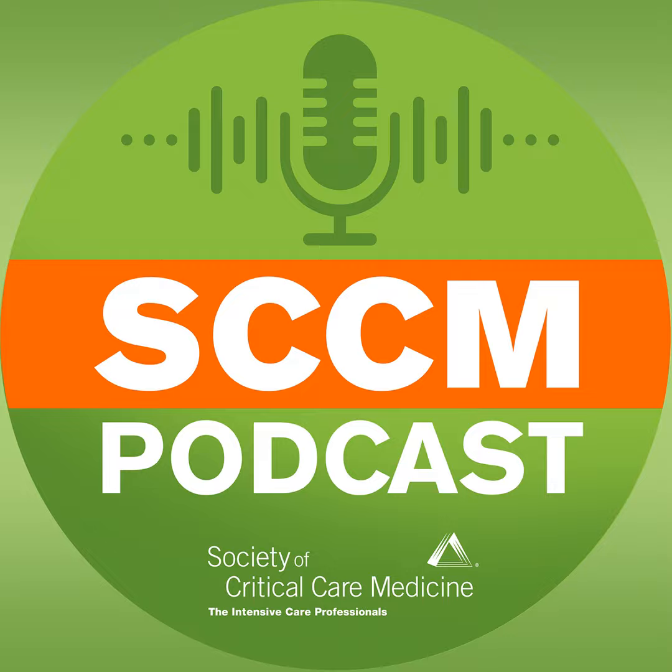The third one is the one which has been described initially, where patients are a little bit in a later phase. They are on pressure support ventilation. It may be some other mode, but it has been mostly described with pressure support ventilation. And pressure support is a very nice way to assist patients, but it's very easy with pressure support to give too much pressure. And too much pressure will mean too much volume and long inspiratory time. And these patients will be completely different from the preceding ones which I described, the patient with high drive.